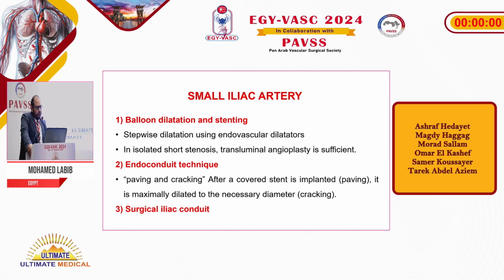For management of a small or calcific iliac artery, we can use balloon dilatation and stenting, or stepwise dilatation by endovascular dilators. The second technique is the endoconduit, which means the paving and cracking technique, which means covered stent deployment followed by maximum dilatation without fear of rupture, as it is a covered stent. And the last option is the surgical iliac conduit.